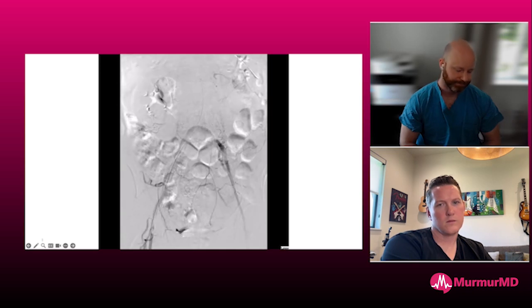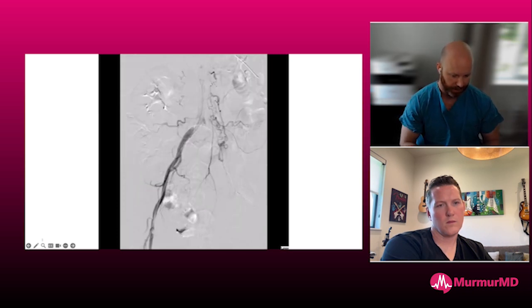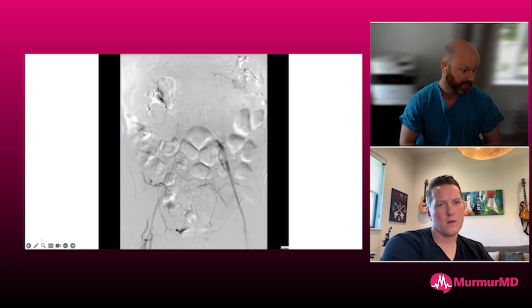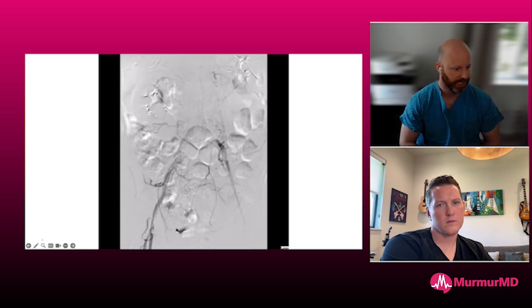I find that actually most people who we do this with increase their pulsatility and pulse pressure width as we wean the Impella, because the Impella really does unload the ventricle and it does decrease the preload. So in the Starling curve, you actually aren't getting as much contractility when you're unloading aggressively, and you don't need to, because the Impella is doing a lot of work. But we actually find people become increasingly pulsatile as we wean them.